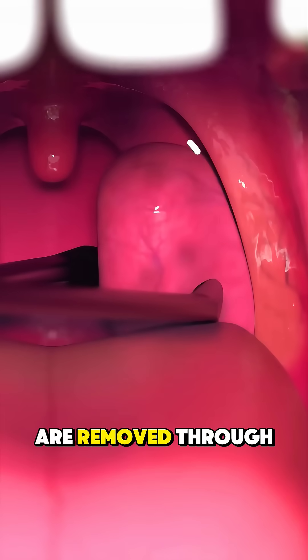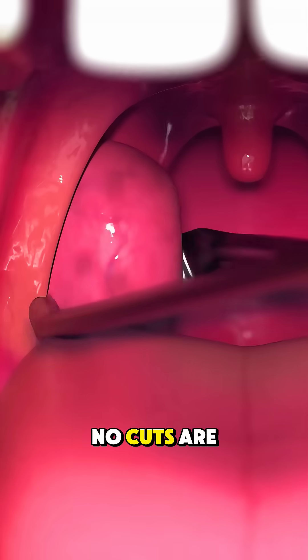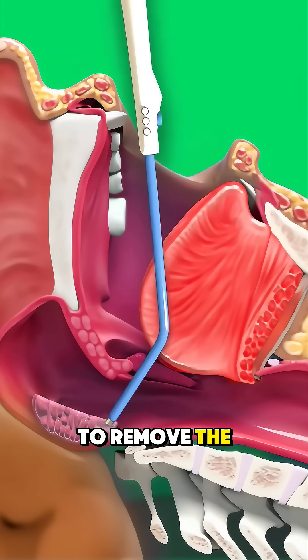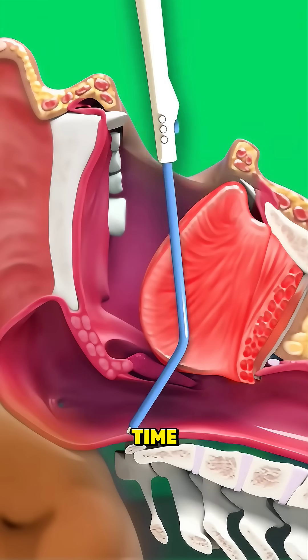Then the tonsils are removed through the mouth. No cuts are made on the outside. The doctor may use a scalpel, heat, or sound waves to remove the tonsils and stop bleeding at the same time.